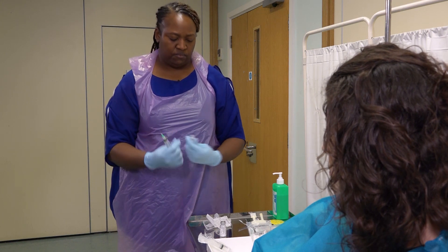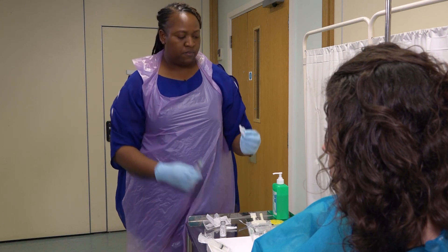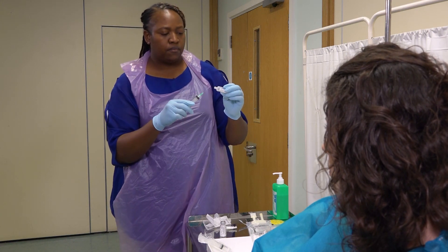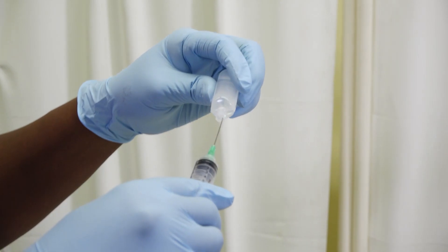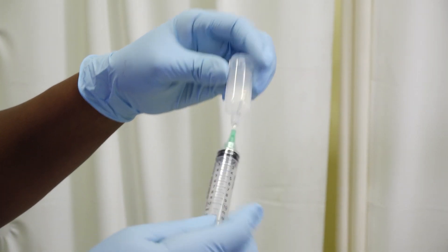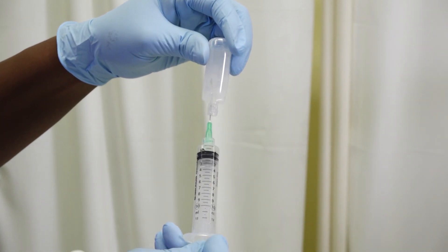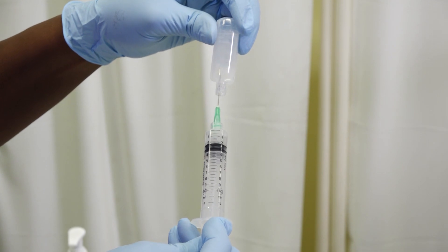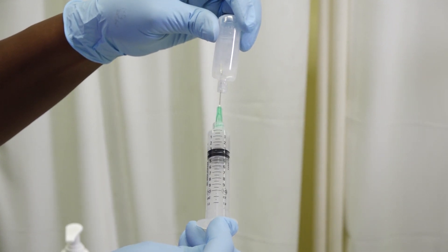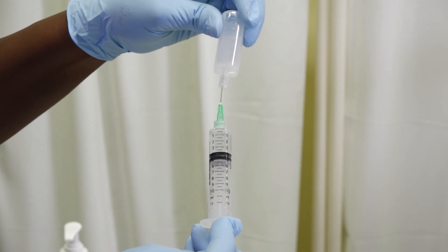Draw up the sterile water using an aseptic non-touch technique. Always check the fluids and equipment are in date.